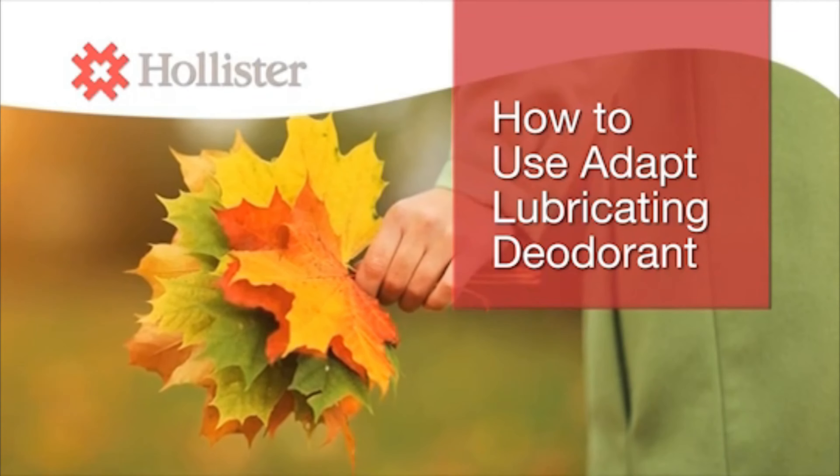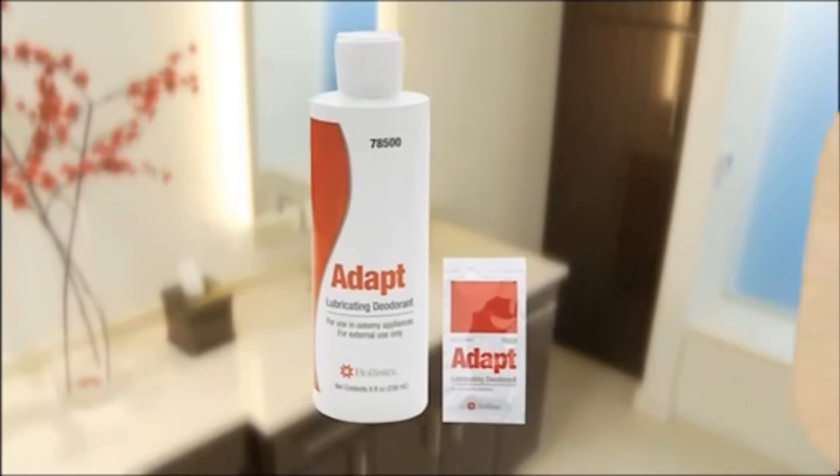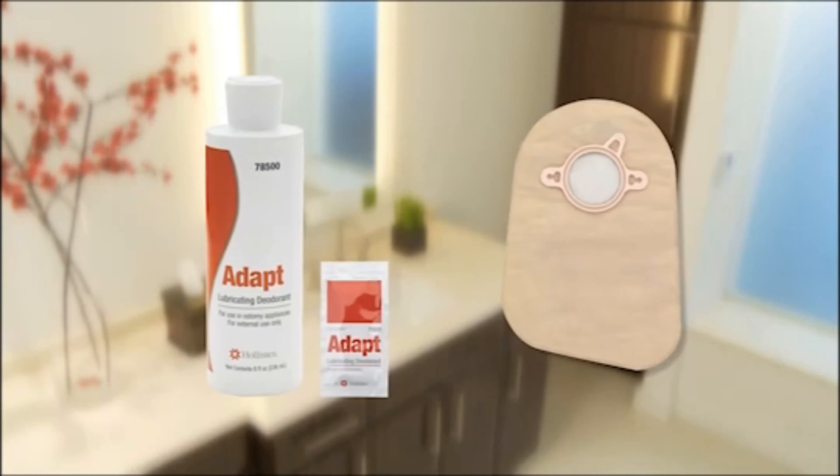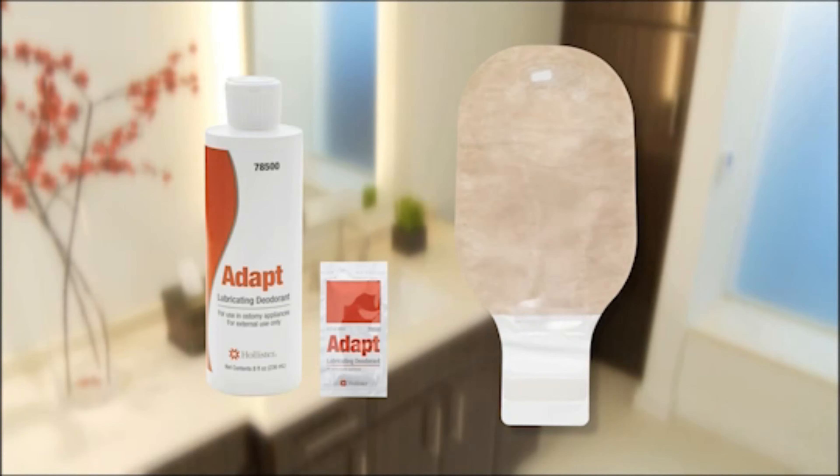You may be concerned about odor when you are emptying your ostomy pouching system. Adapt Lubricating Deodorant from Hollister neutralizes pouch odors. It is colorless and odorless. An additional benefit is that it contains a special lubricating ingredient that helps make it easy to empty your pouch completely.